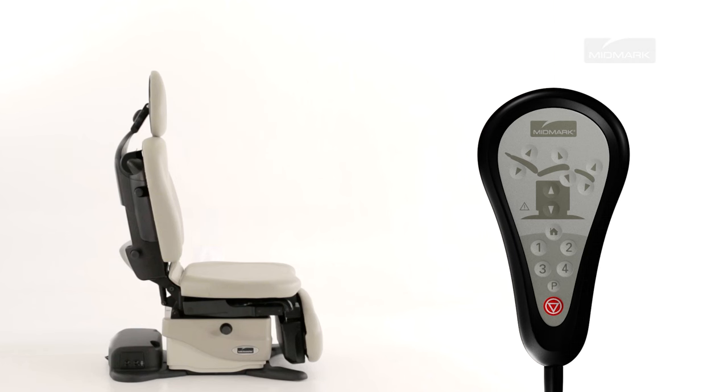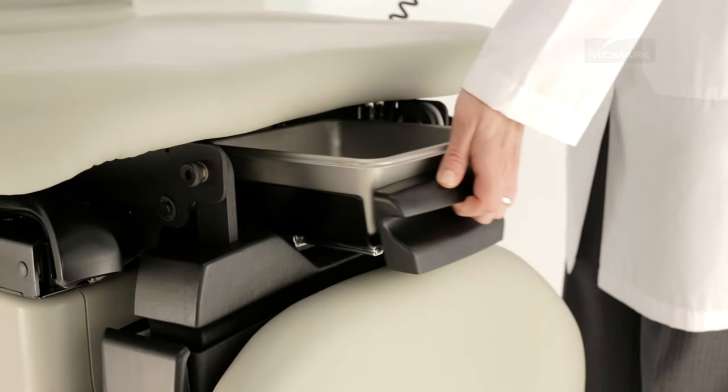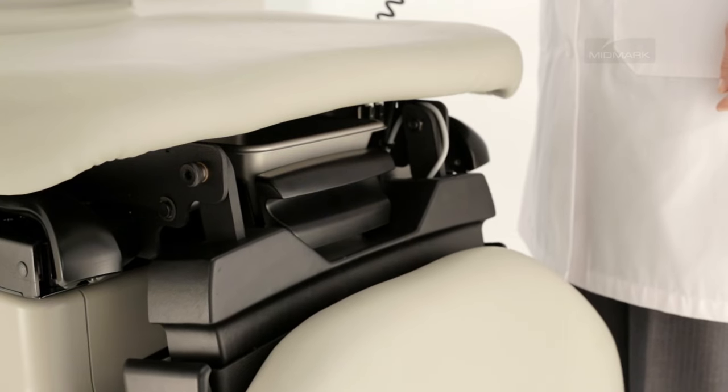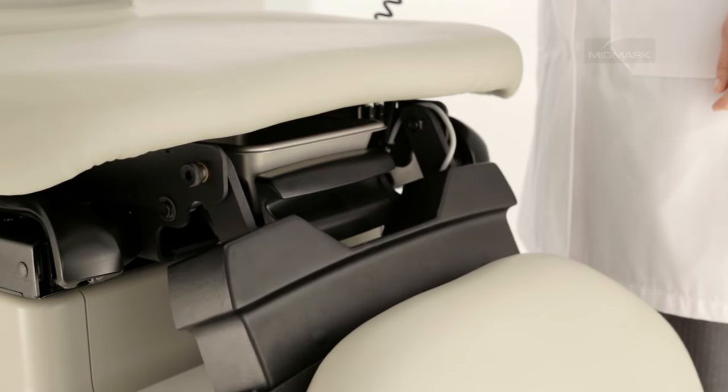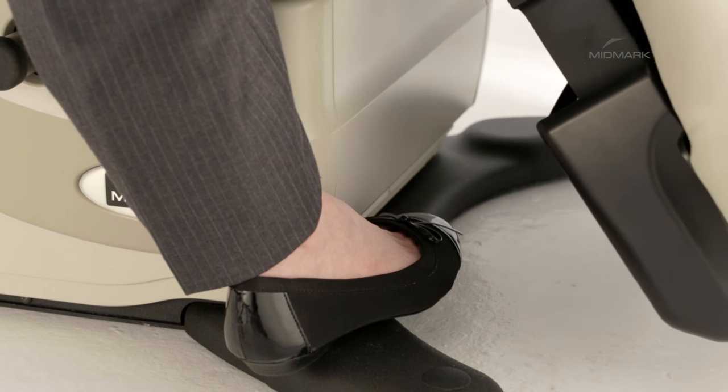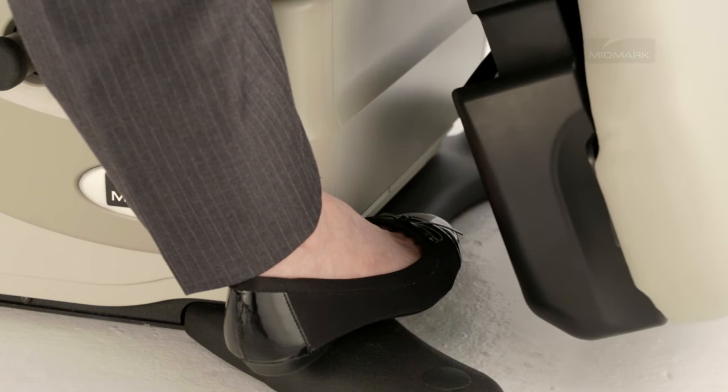To move the foot section up or down, press and hold the appropriate button on the table hand or foot control. Movement stops when the up or down button is released, the maximum or minimum position is reached, the active sensing technology is activated, or the stop button is pressed. The active sensing technology will disable the foot up function when the treatment pan is not in the stowed position, and will disable the foot down function if the foot section contacts an object other than the table. You will hear a single beep when activated.